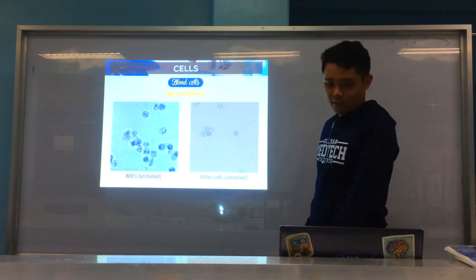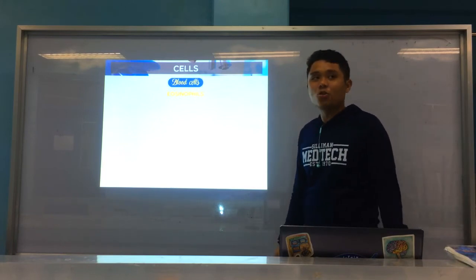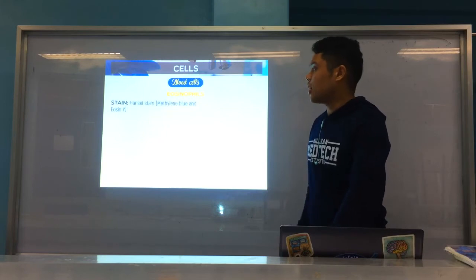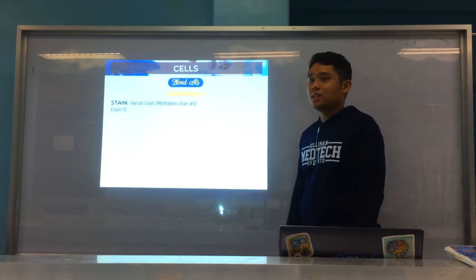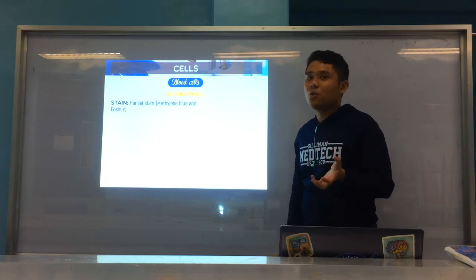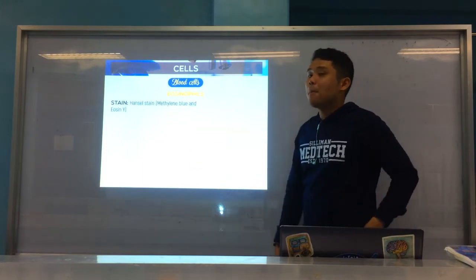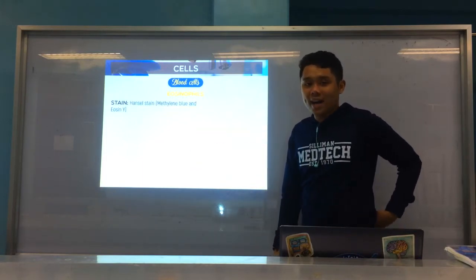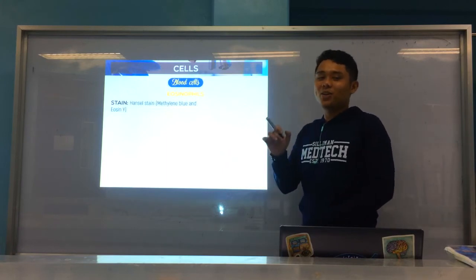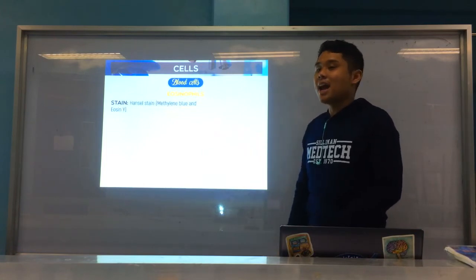That's for neutrophils. All right, now we go to eosinophils. Eosinophils are not normally found in urine, and can only be seen or stained if you want to visualize them using the Hansel stain. So if the question is, what is the primary stain of choice for eosinophils in urine? Hansel stain. What is the composition of Hansel stain? Methylene blue and eosin Y. What is the composition of Sternheimer-Malbin? Like a gram stain, but don't answer gram stain: safranin O and crystal violet. For Hansel stain, it's methylene blue and eosin Y.